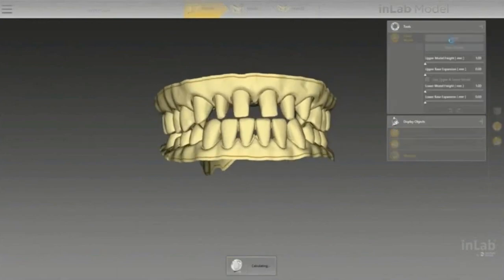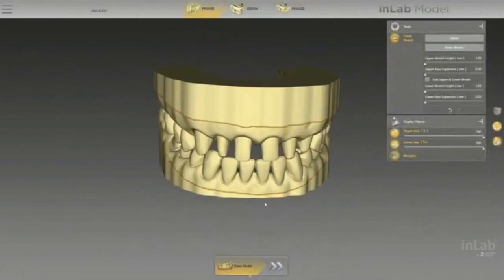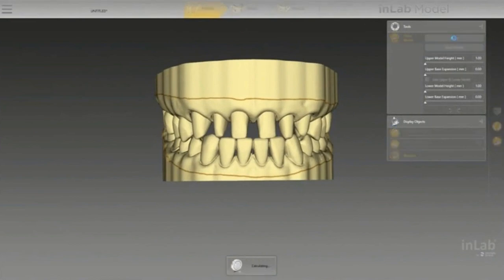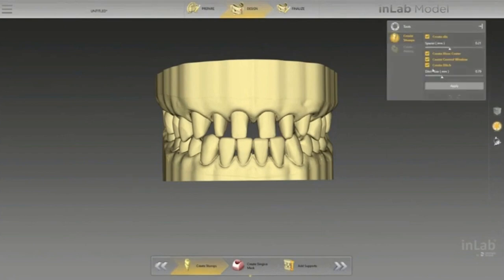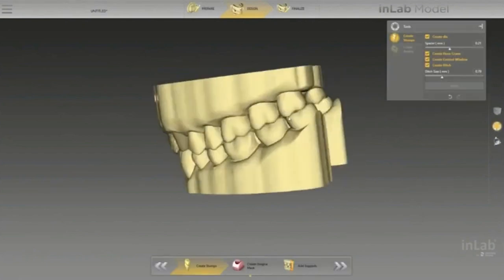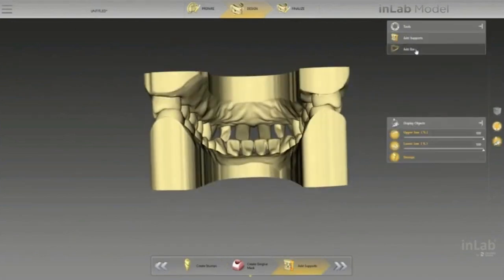Now, because I'm already inside the InLab software, and I don't have a physical model because I did not take impressions with PVS, but I have the digital impressions, what I'm going to do is create a physical model, and also some dies. So we're going to be able to mill our restorations and fit them in these models, and we want a nice passive fit. So when the patient comes in for the final restorations, we don't have to do literally any adjustments at all, because everything's been done in the model. So I'm creating a model right now. As you can see, I just created the dies that I'm going to be able to remove. Okay, and then we're going to print this.